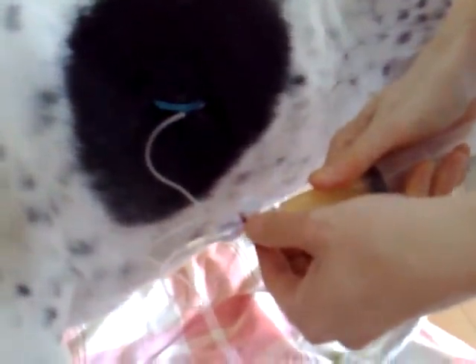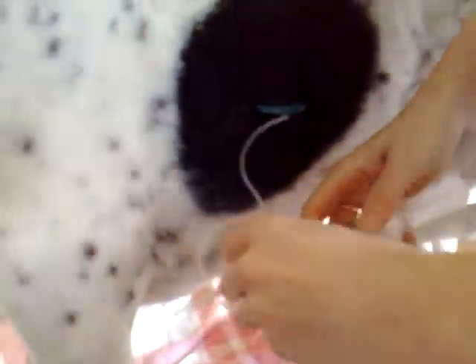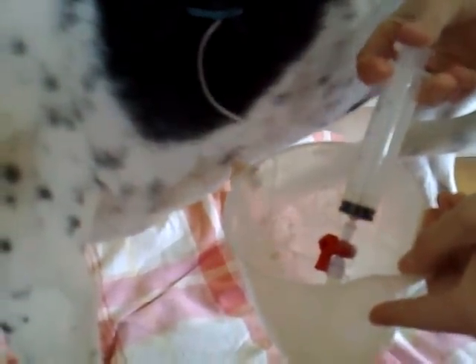To avoid infection, to release the fluid, turn the three-way tap. Push the fluid out into the jug.